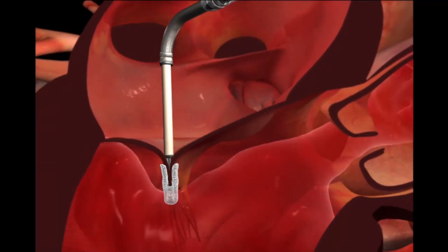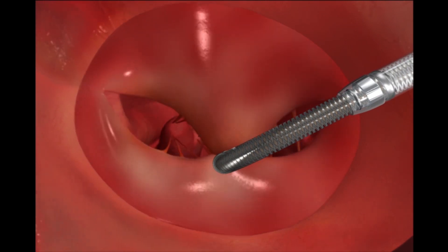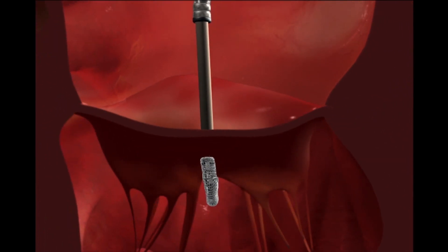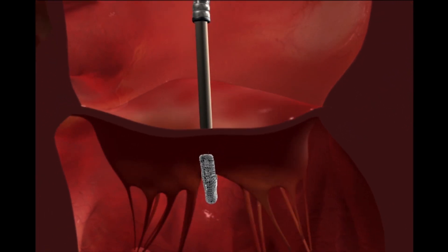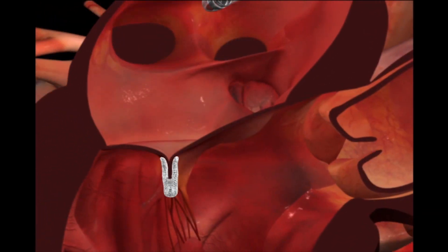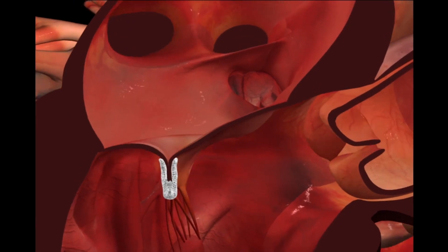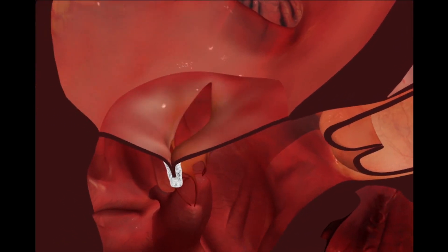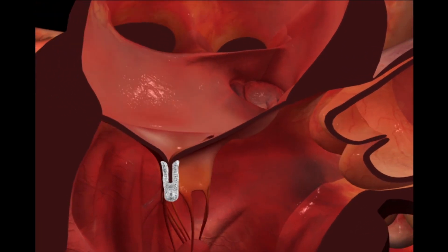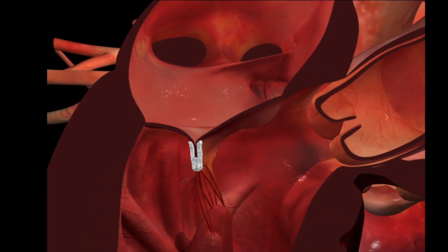Then we deliver the clip through the leaflets and come up and capture the leaflets in the clip. We drop these little things called grippers, close the clip, and now the leak is completely abolished — it makes two holes instead of one big hole, but the area of the leak is completely closed. This is all checked under echo guidance. Then we release the clip, which stays in place and actually becomes incorporated into the valve itself. The blood can flow normally from the upper chamber into the lower chamber through the two holes created, but the leak going backwards is abolished.